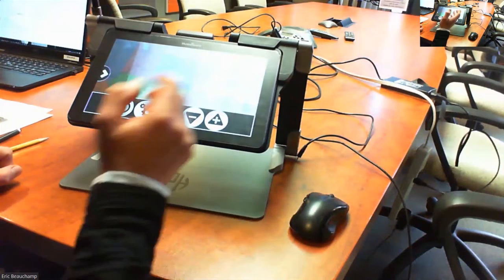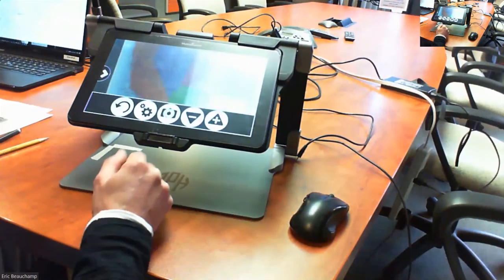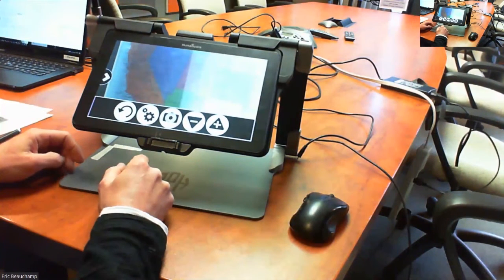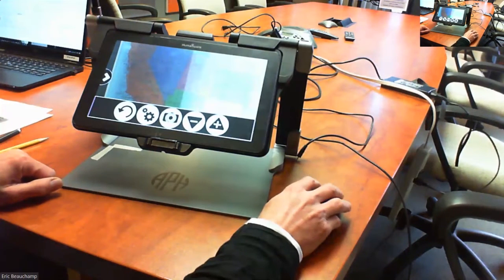Now, I don't know if it's because of the lighting in the back, because I put it on a window here, that you're not getting the right text on there. But there we go. It made the focus on the darker part. You can see the cities and the states. But you can zoom in really nicely, and also if you see that the student is way in the back of the room, you can move that distance camera.